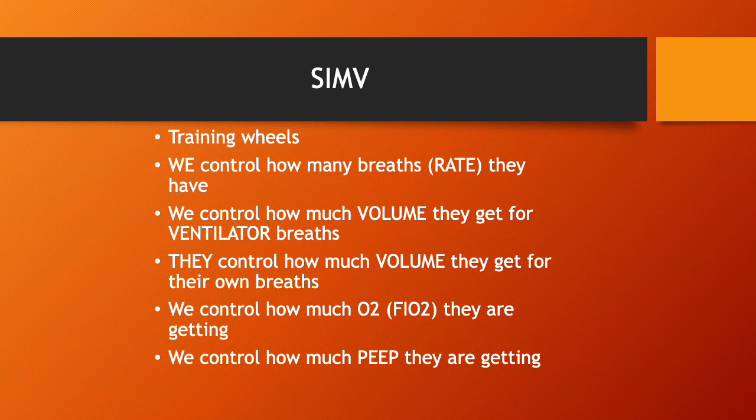But effectively, the patient may have just ventilator breaths. They can have their own breaths, and when they do take their own breaths, they can try to breathe on their own. So this is a great mode for a client that's maybe getting ready towards weaning, or might be ready to start trying to take some breaths on their own. We're going to be able to see how well they can breathe when they are trying to take their own breaths, which is really helpful to know how they're doing on their own if the ventilator wasn't there to help. We're still going to control how much oxygen, and we're still going to control how much PEEP they're getting.